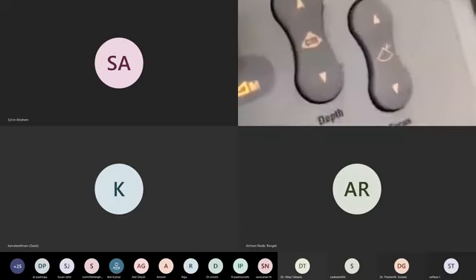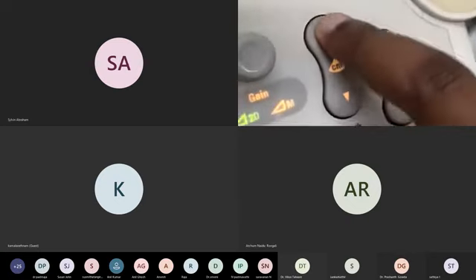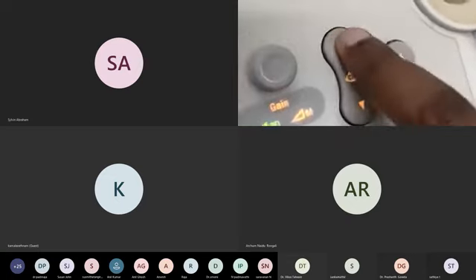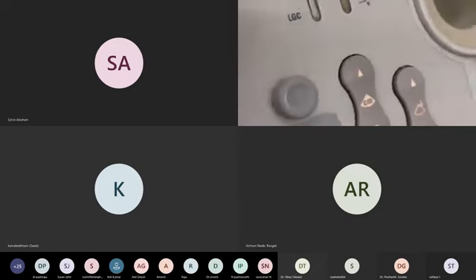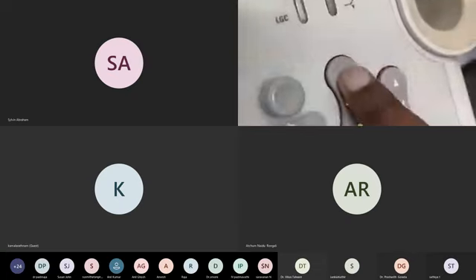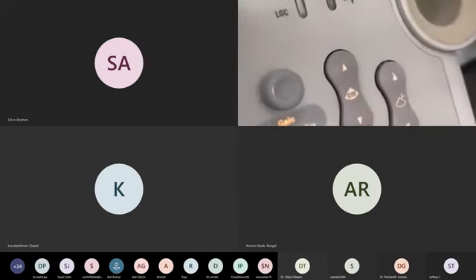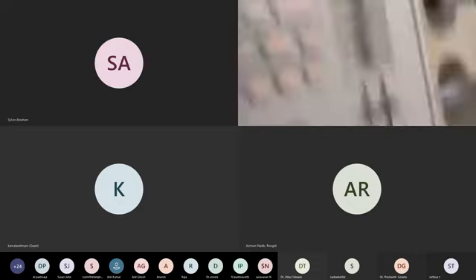Yeah, okay, hold it. See, depth is very important in lung ultrasound. See, now I am reducing the depth. How much do you hardly want to see in a neonatal chest? 2 centimeters below the skin or 3 centimeters below the skin. See how many centimeters you are going. So now I will press this or I will press this, and it will change. Okay, come here.